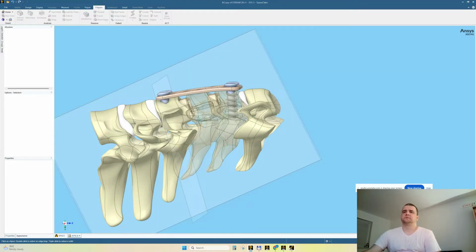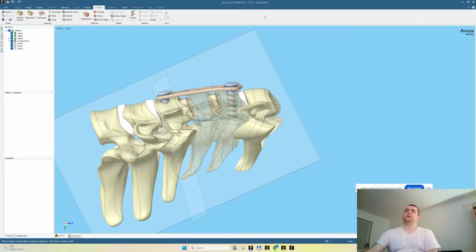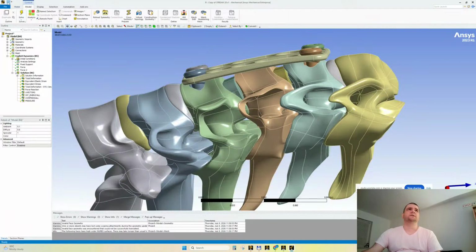Come on. Why do you keep closing this window? Why? Update. Update. Yes. This is what we wanted. This is what we needed. Save here.